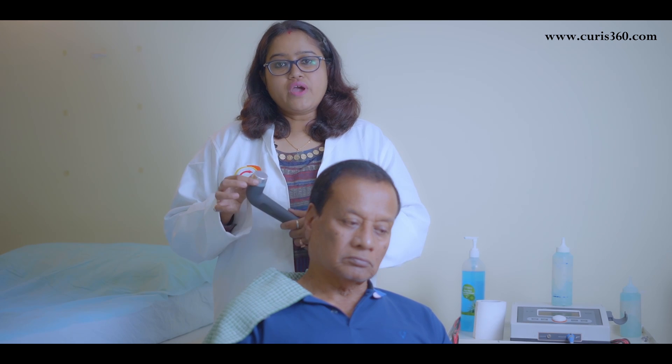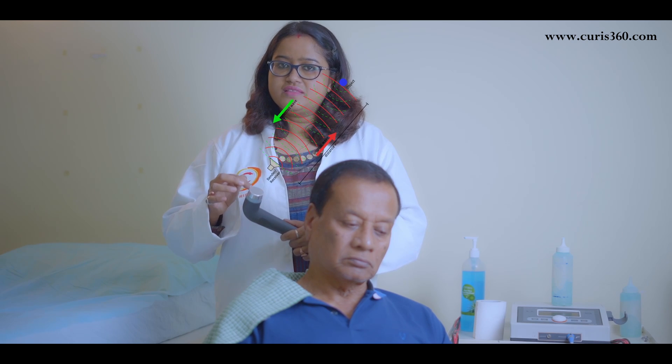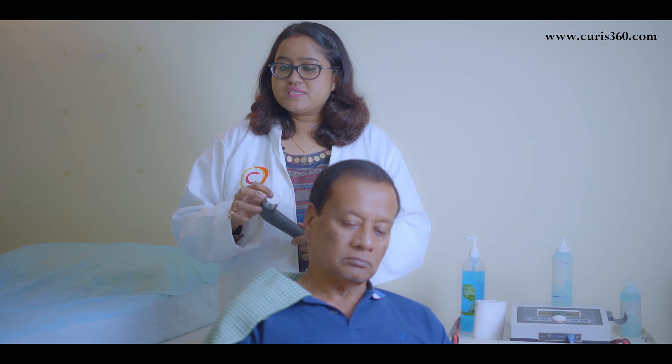Let's understand how this ultrasound is going to help us. This ultrasound head produces ultrasound waves. As you can see, this is the ultrasound head and there is a crystal underneath it. This crystal vibrates and produces sound waves, which penetrate inside the body and help in healing the tissues.